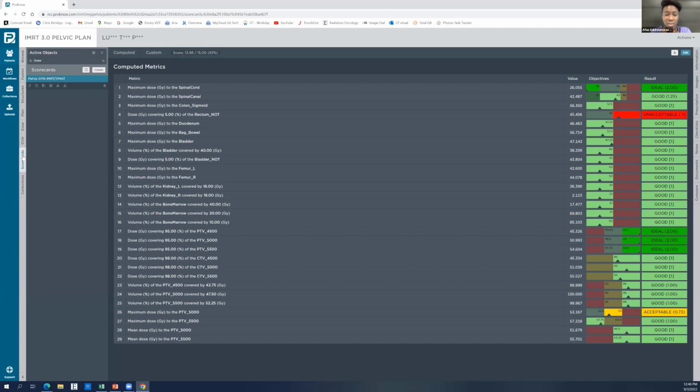But I figured since we're on the topic of chest wall, I wanted to drop that in. We really don't do IMRT for left breast or right breast. We do field and field techniques for that, so we're using more of a 3D conformal, if you will. We use a breath hold technique for left breast, and we do not do a breath hold for the right breast. That's the difference. That's to spare the heart. Yeah. So we don't do VMAT or IMRT for either situation.